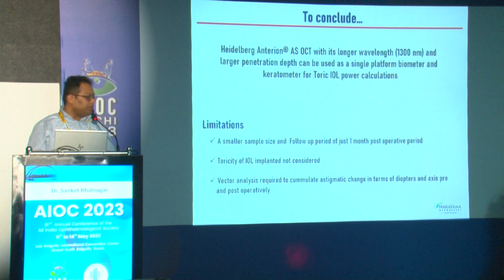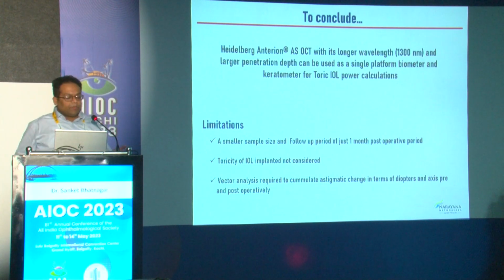But this study was not without its limitations. It had a smaller sample size and the follow-up period was only 1 month post-operative. Also, the toricity of IOL implanted was not considered, which can be a confounding factor. And vector analysis, we are looking for more sample size, so it's in the pipeline. And maybe in the future, we'll be presenting the vector analysis where we can see the change in diopter and axis pre and post-operatively. Thank you.